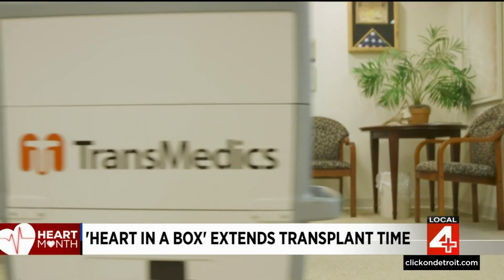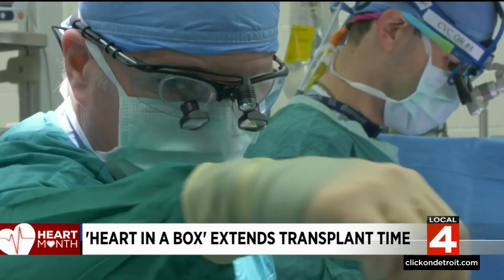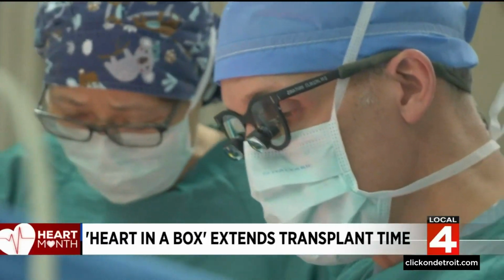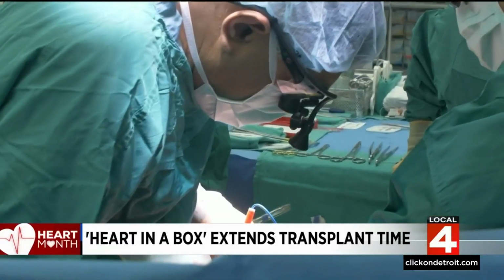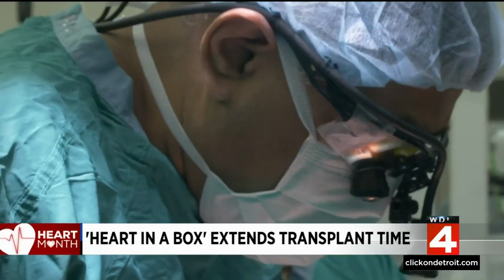And Michigan Medicine researchers are looking to push this advancement even further. There still are limits. You can only perfuse the organs on this system for a finite period of time. We are trying to understand in our laboratory, under the direction of Robert Bartlett, what are the factors that contribute to the inability to perfuse these organs for longer periods of time, trying to identify what we can do to eventually achieve our goal, which is organ banking.